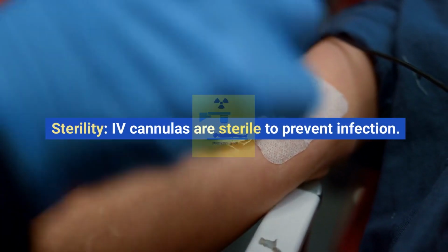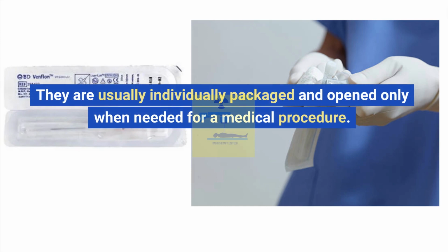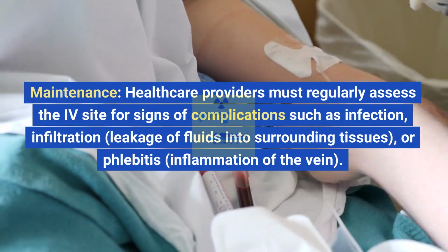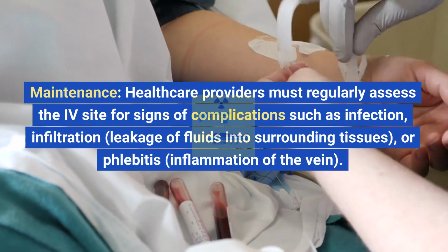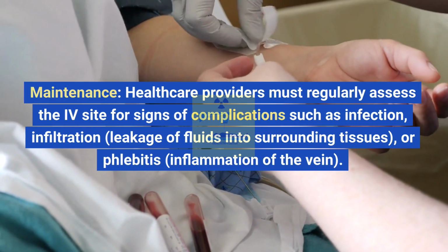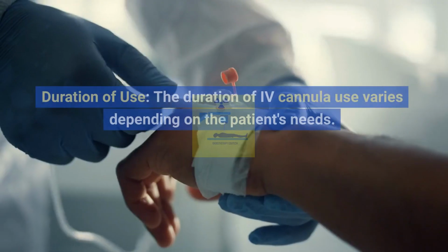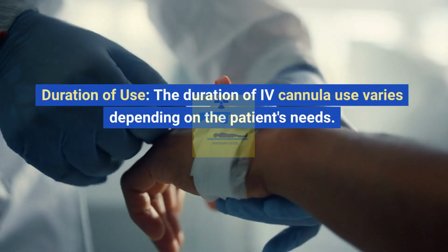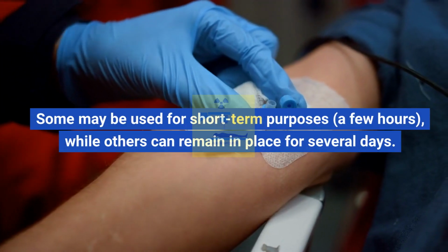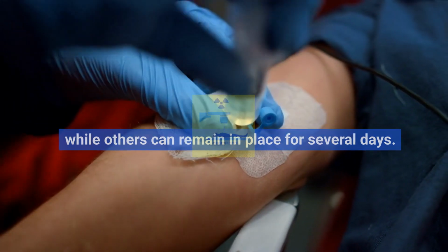Sterility: IV cannulas are sterile to prevent infection. They are usually individually packaged and opened only when needed for a medical procedure. Maintenance: healthcare providers must regularly assess the IV site for signs of complications such as infection, infiltration (leakage of fluids into surrounding tissues), or phlebitis (inflammation of the vein). Duration of use: the duration of IV cannula use varies depending on the patient's needs. Some may be used for short-term purposes, a few hours, while others can remain in place for several days.